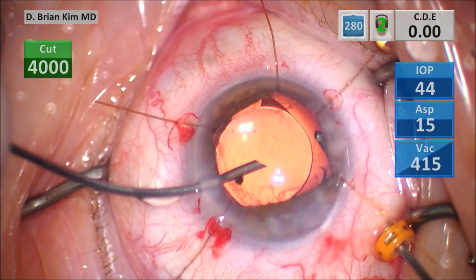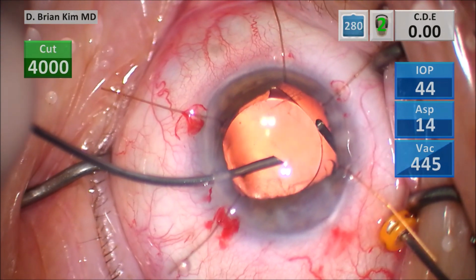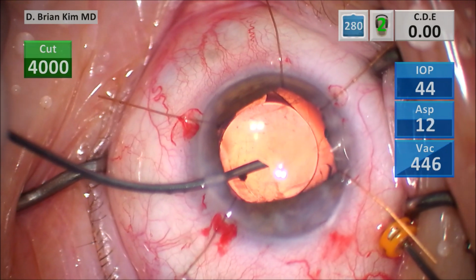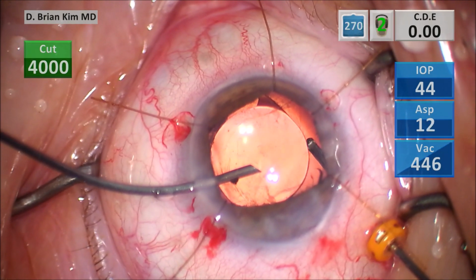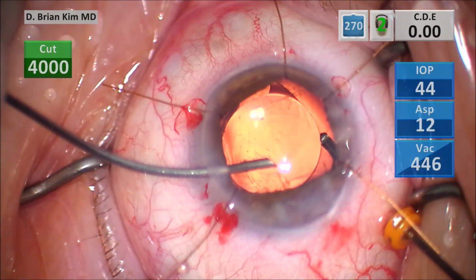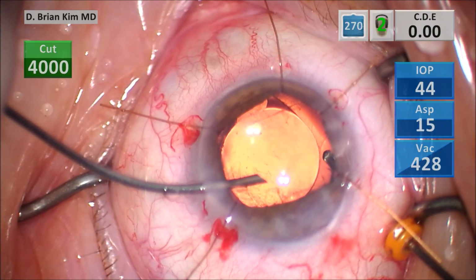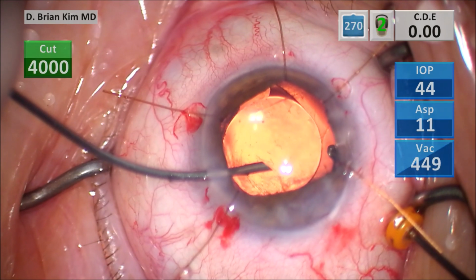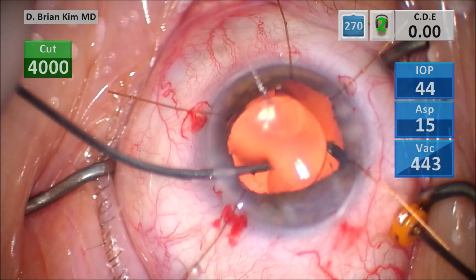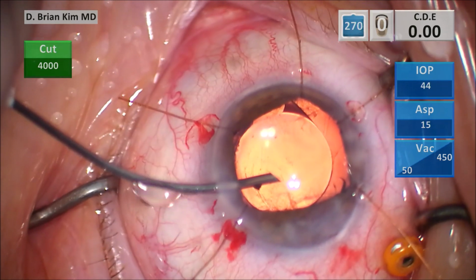Again, I had an anterior capsule tear, placed a new lens into the capsular bag, a single piece acrylic lens, positioning the haptics away. But again, while I was doing IA, that infusion pressure must have caused that capsule to split. And then because of that high pressure and volume, caused the vitreous to come forward, lens position shallowed, and it tilted, shifted over. And so because of that, I had to go in through the pars plana, remove that volume, the vitreous and just the volume there.